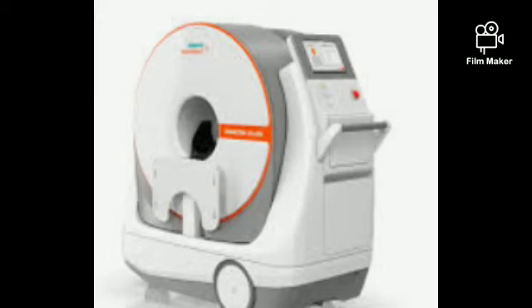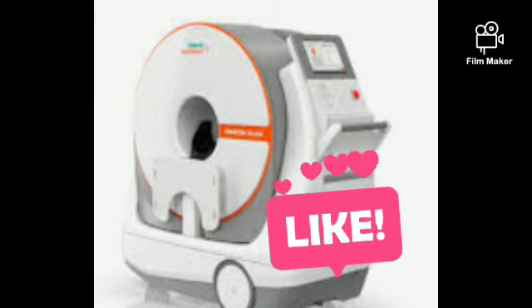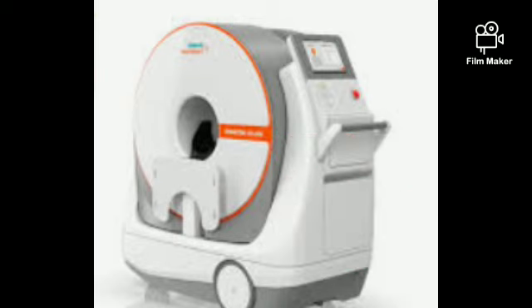And now we are in another session, and I hope it is very easy now for you to operate your CT scan machine. And this is the newly launched mobile CT scanner. It is used mainly in OTs for having three-dimensional views during surgeries, and it's very helpful nowadays.